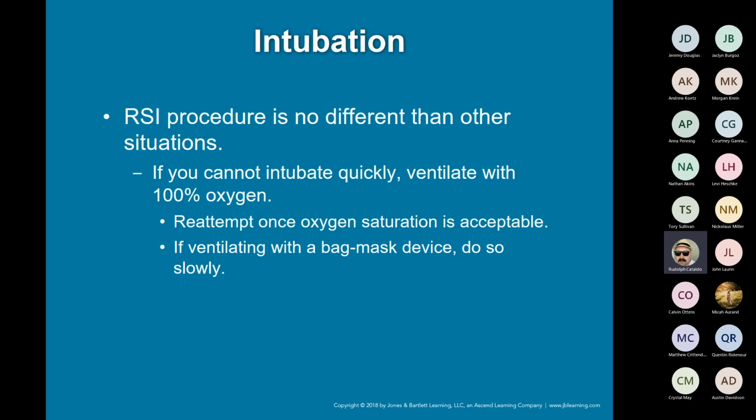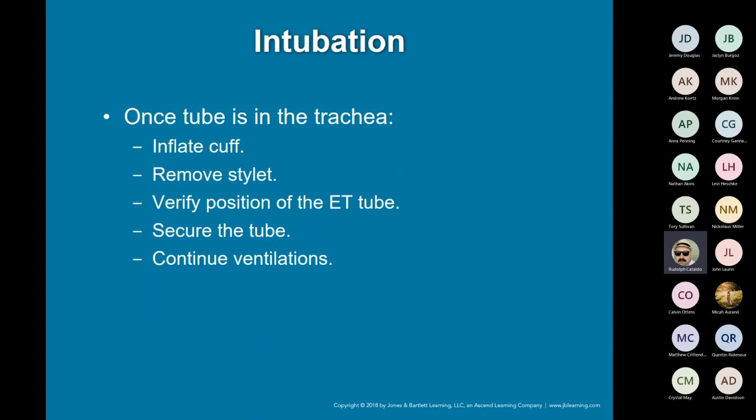But again, I rely off of end tidal as well. So if I get this patient intubated, end tidal is really high, I know that I need to bag them a little bit faster, knock that end tidal down. Whereas if end tidal is really low, then I probably need to slow down my breaths. And this is something we are covering in lab this week.